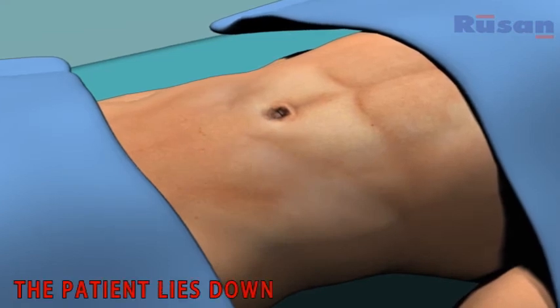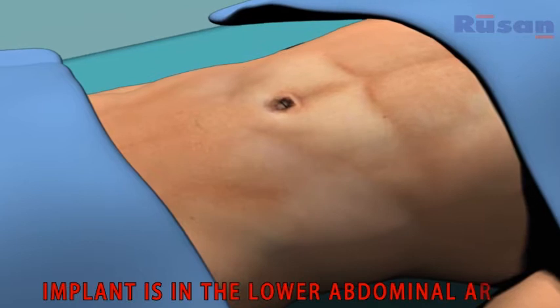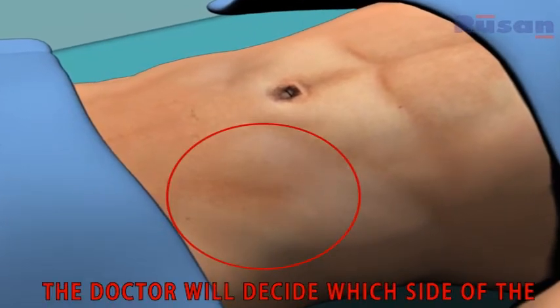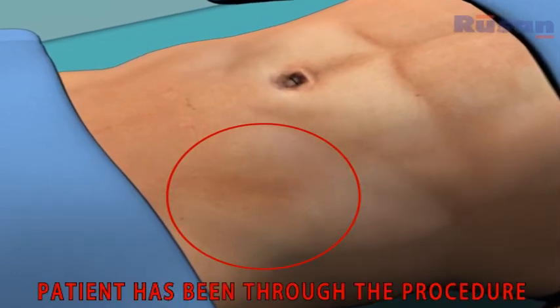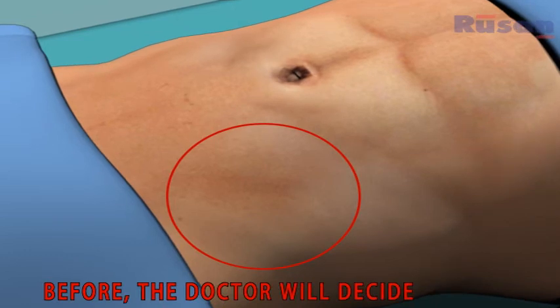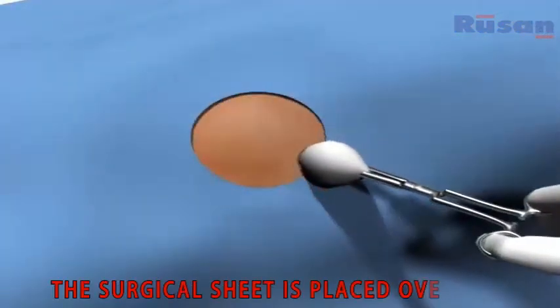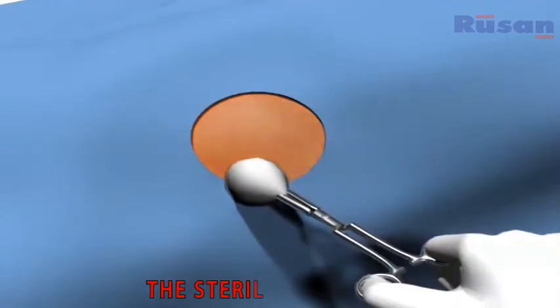Step 2. The patient will lie down on the surgical table. The recommended site for the implant is in the lower abdominal area. The doctor will decide which side of the abdomen the implant should be inserted. In case the patient has been through the procedure before, the doctor will decide the side accordingly. The surgical sheet is placed over the abdominal area and the surgeon prepares for the sterile procedure.